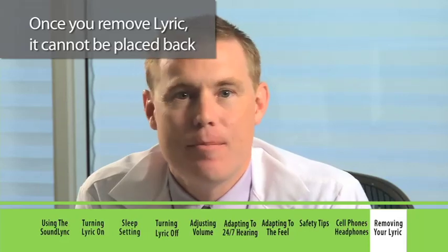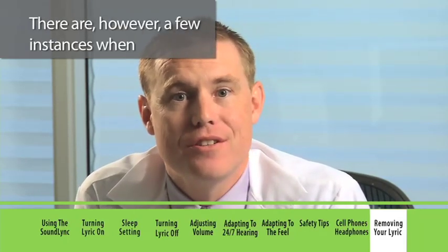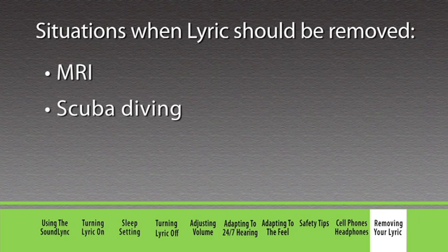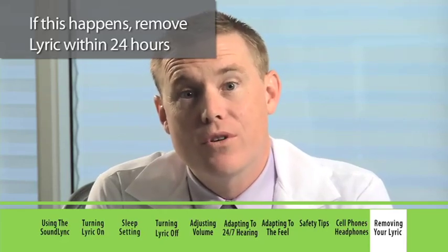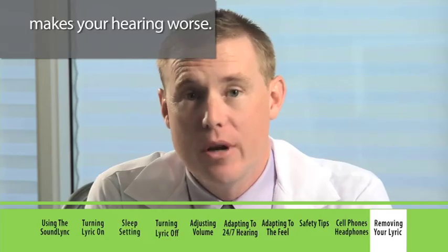Once you remove Lyric, it cannot be placed back into your ear. There are, however, a few instances when your Lyric should be removed: when having an MRI, when scuba diving, if you have extreme and constant pain, or if your Lyric stops working and you cannot get to your hearing professional's office. If this happens, remove Lyric within 24 hours, since a non-working device acts like an ear plug and makes your hearing worse.